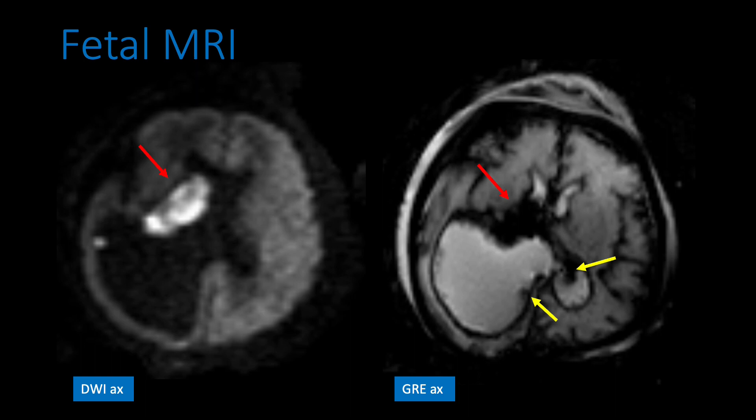Additional fetal MRI axial images demonstrate hyper-intense signal on DWI and blooming on GRE within the medial right thalamus, consistent with intraparenchymal hemorrhage. Layering blood products are also noted within the posterior horns of both the right and left lateral ventricles. ADC images not shown confirmed no presence of acute infarct.